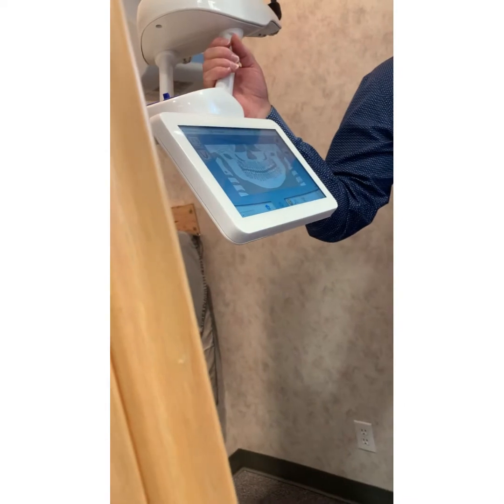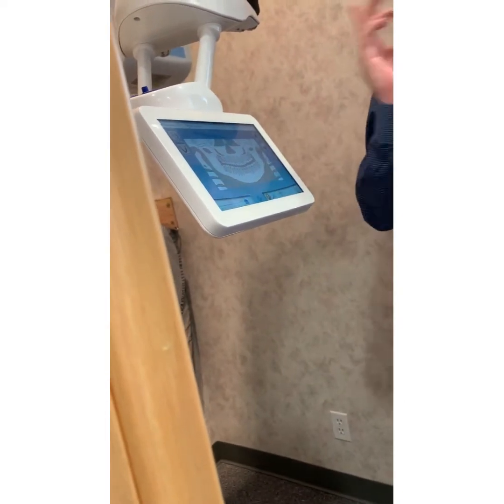All right. Everything I'm showing you for 2D, you're going to mimic stance-wise and in your protocol for both 2D and 3D, so you're not thinking, oh no, this is 3D, what am I doing differently? No, it's all going to be the same for you guys.